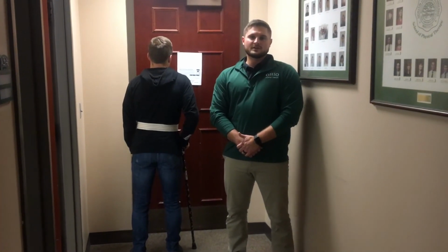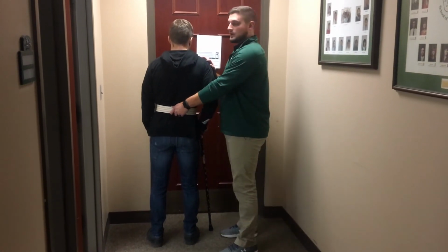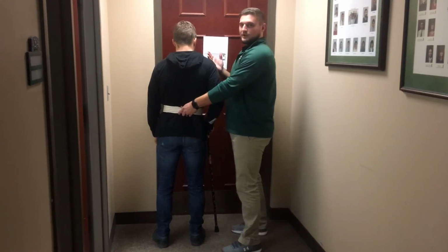When traversing a doorway using an assistive device, be sure to always use proper contact guarding. Also, be sure to use proper verbal cueing so that the patient knows the directions. So, an example of that would be this.